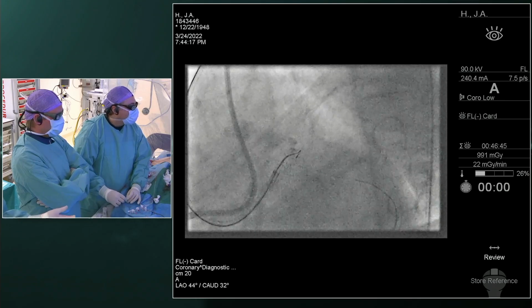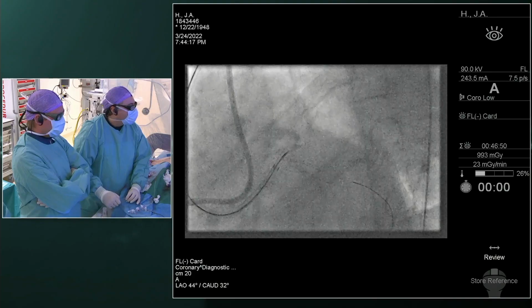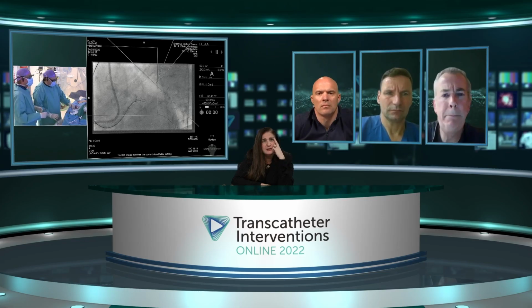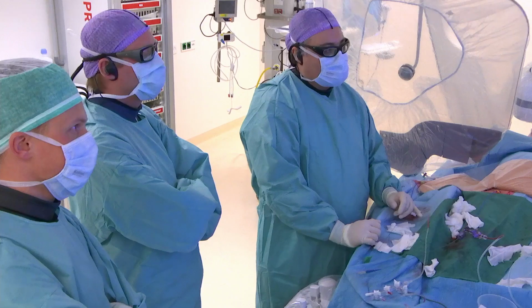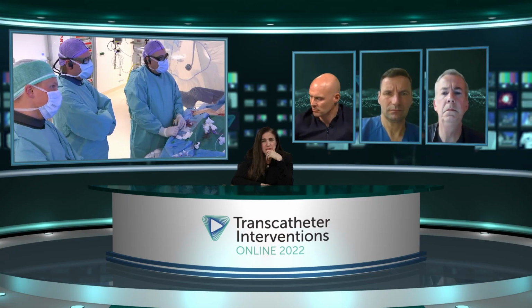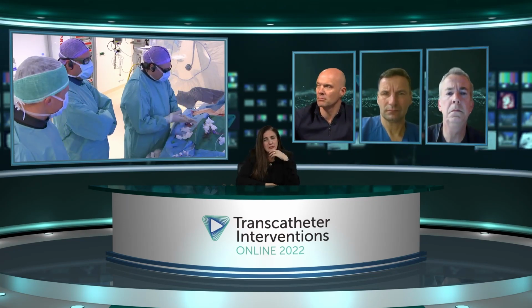I'm thinking that soon you'll be deciding if you're going to go retrograde. I mean, I would be. That's correct. I would just be careful because you don't want to cause damage. I think we're going to have some feeling for retrograde now because we have tried quite a lot. If we can go retrograde, then it's an important step.